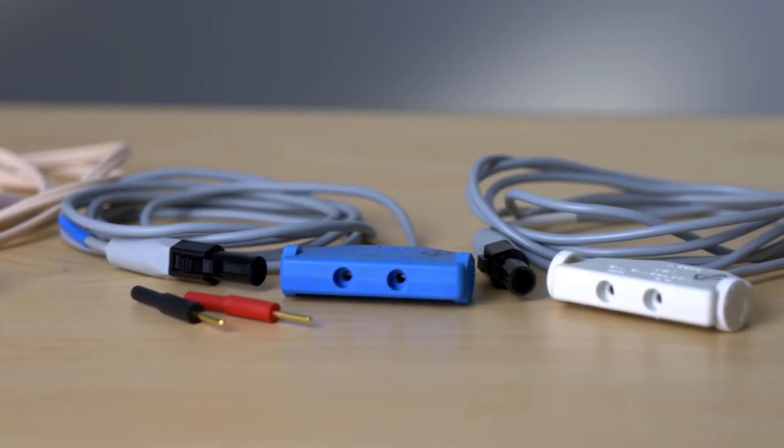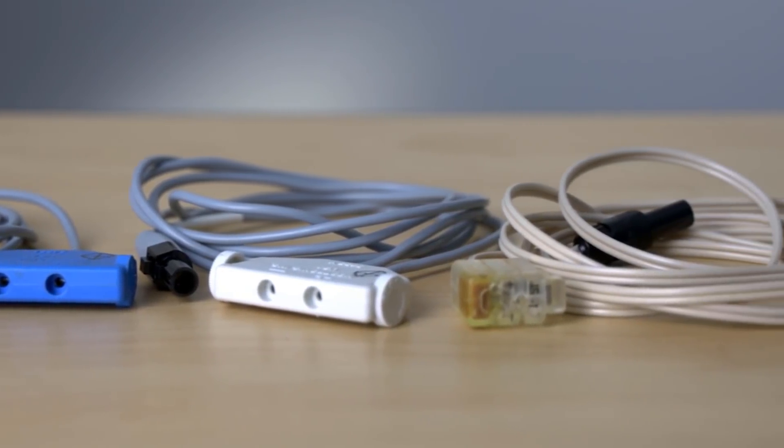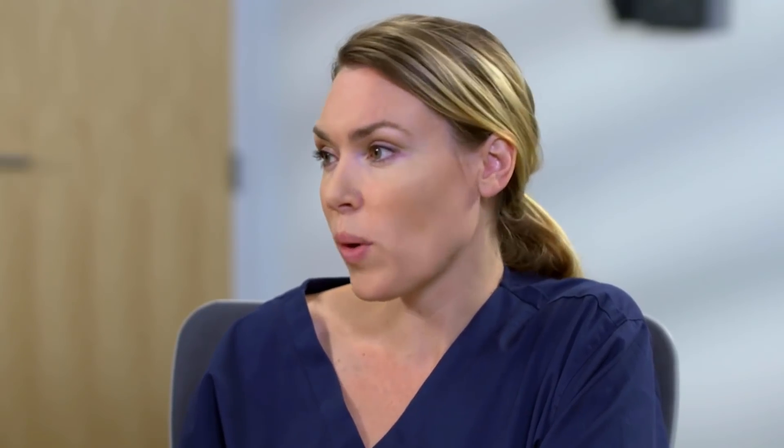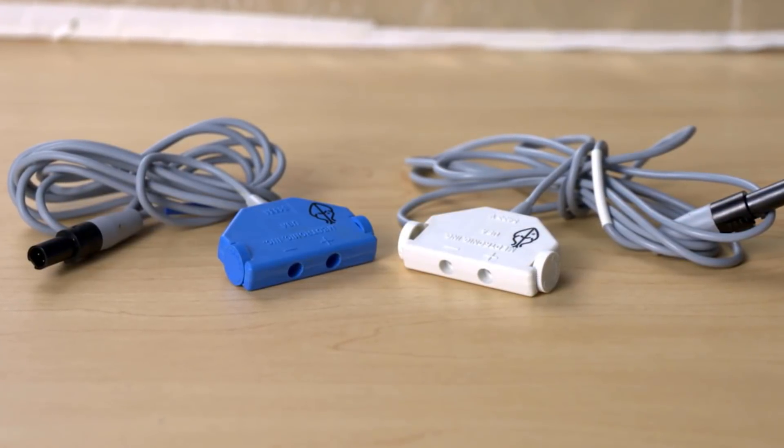There are various connectors on the cables that we'll discuss. There are also reusable cables and disposable cables. So disposable cables are for one-time use. Reusable cables can be cleaned and reused. There's a really simple way to tell them apart: the disposable cables are beige in color and the reusable ones are gray.